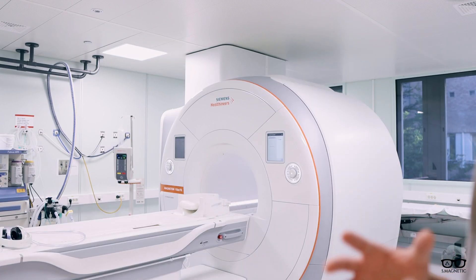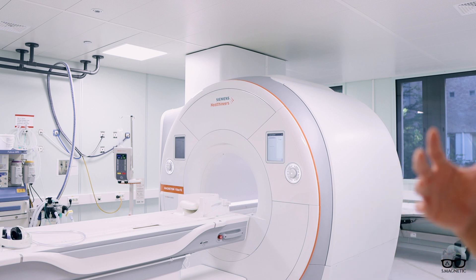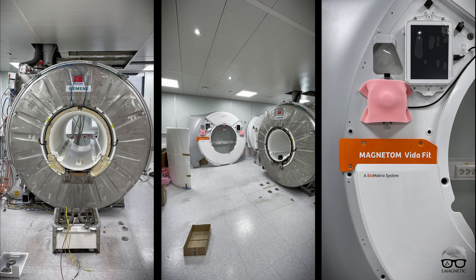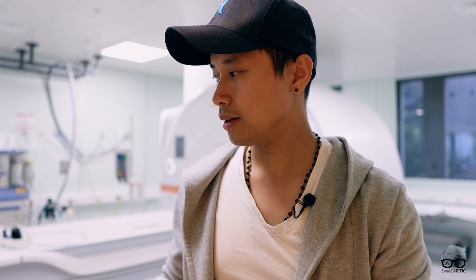Right behind me is the Vida Fit. As you can see, back in 2011 we got the Skyra installed, and we had the Skyra for many years. But just recently we installed this Vida Fit — basically a Vida, but it's 'Fit' because it's upgraded from the Skyra. It's a big jump for us going from the Tim 4G platform, which is the Skyra, to this new Bio Matrix system. It's just awesome — many new features and I'm very happy so far.